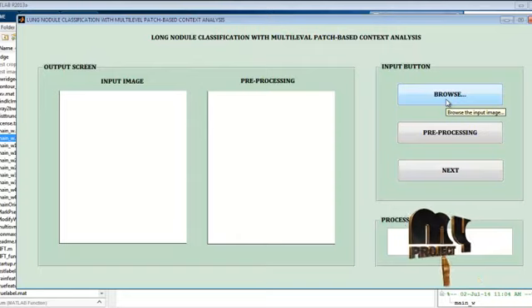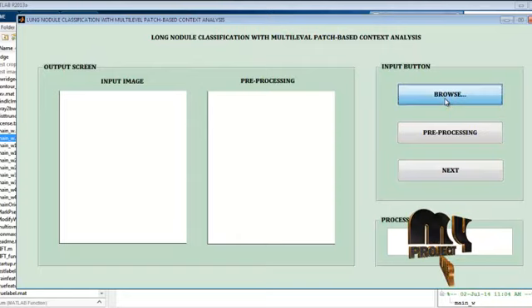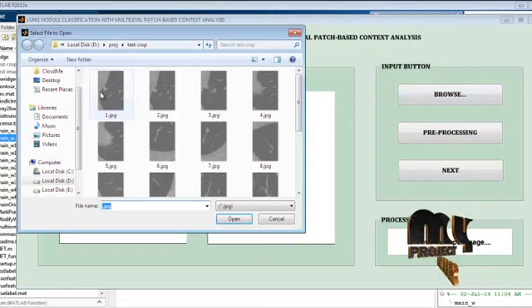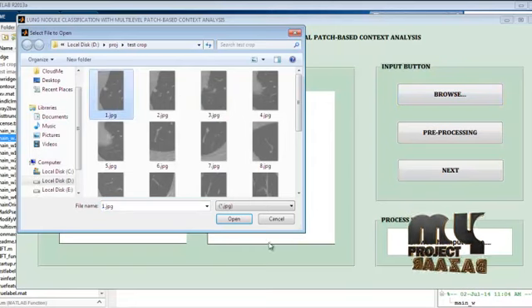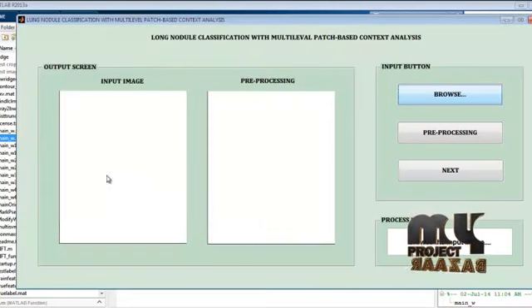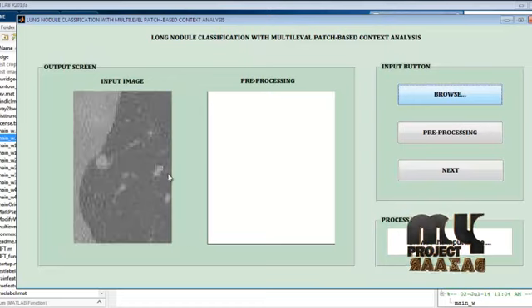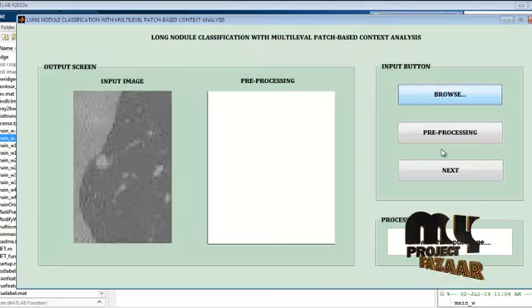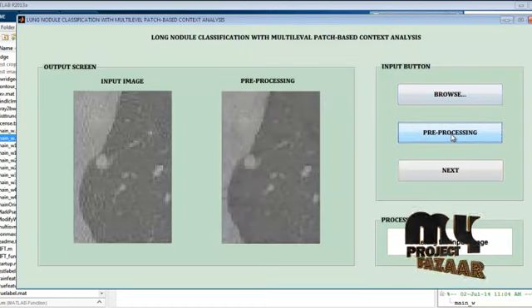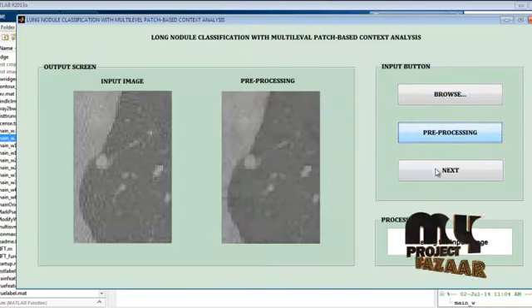First, browse the input lung nodal image from the database. The input image is then displayed. Then go to the pre-processing step, which uses the 2D order statistic filter.